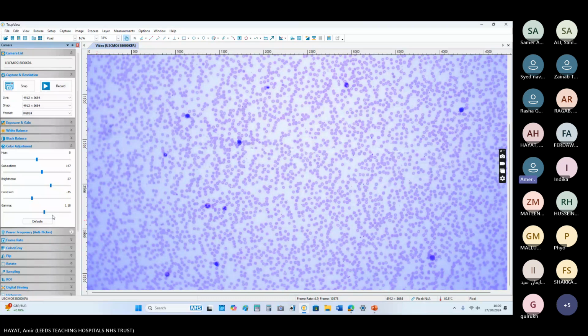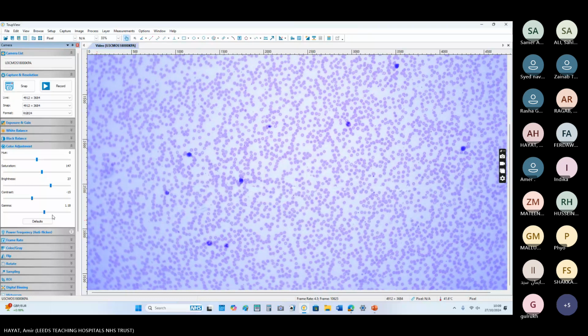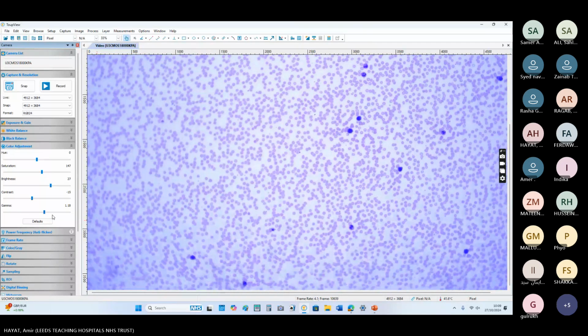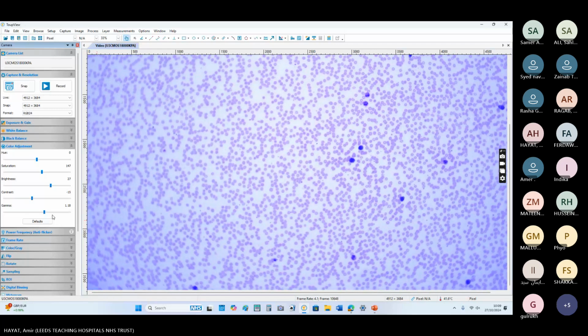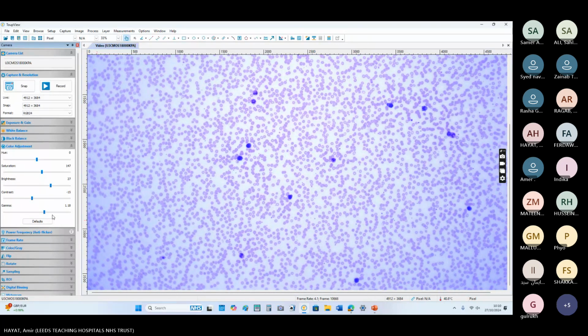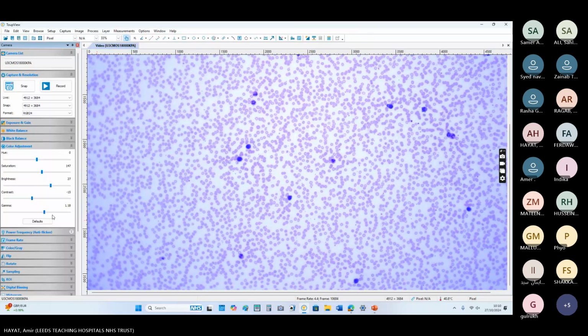The blood test shows AKI stage 2, hemoglobin 90, hypercalcemia, and this is the blood film. Any volunteer?